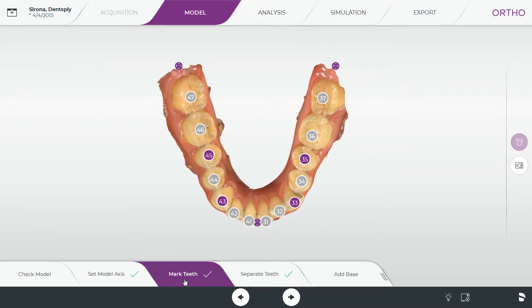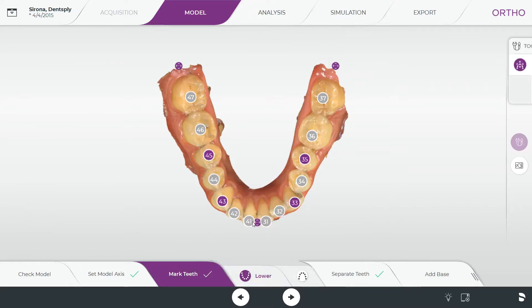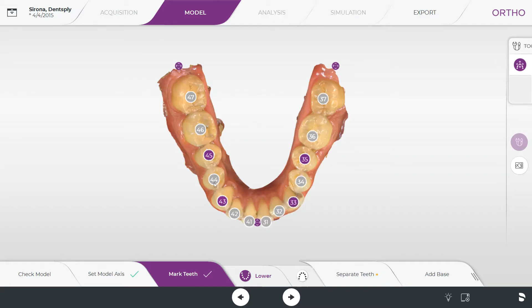The next step is marking the teeth, which is very simple. You're essentially just telling the software which tooth is which tooth number, so it can separate the teeth and determine the arch line. All you have to do is grab these little purple dots and move them over the occlusal surface of the tooth, then grab the gray dots and move them over the occlusal surface as well. It doesn't have to be perfect, just close.